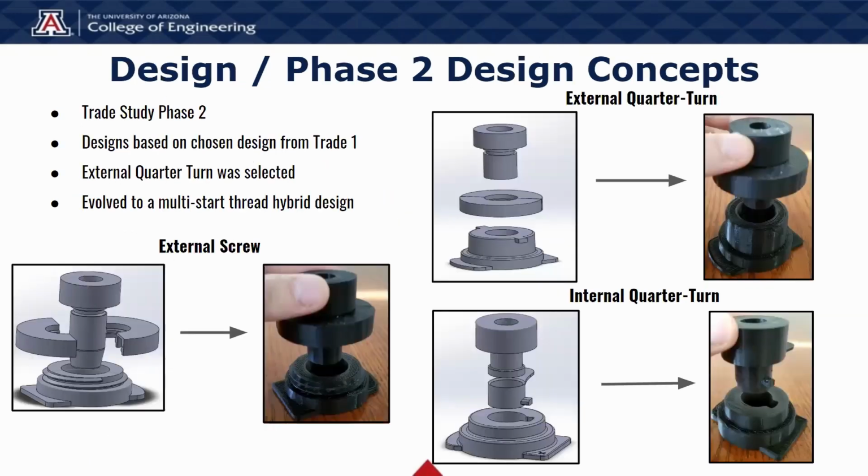For the phase two design concept, there are three designs. The first one is the external screw design. The second one is the external quarter turn design. And the third one is an internal quarter turn design. We selected the external quarter turn design because when we were tinkering with the prototype, it was the most reliable of all the designs. And we eventually evolved it into the multi-thread hybrid design.